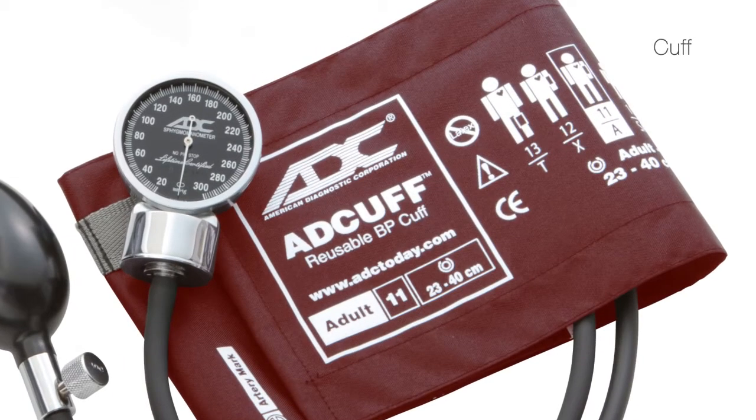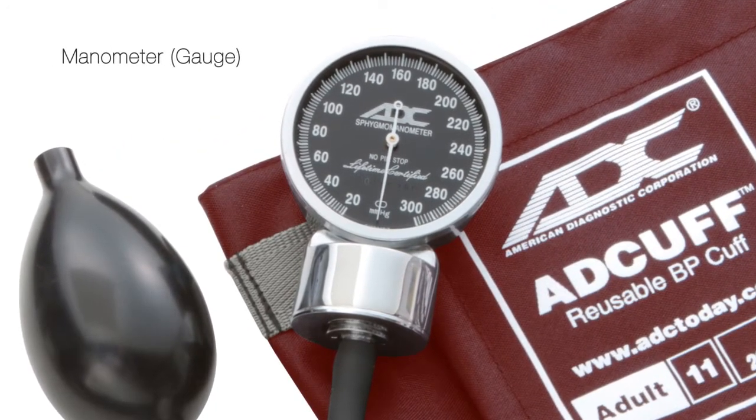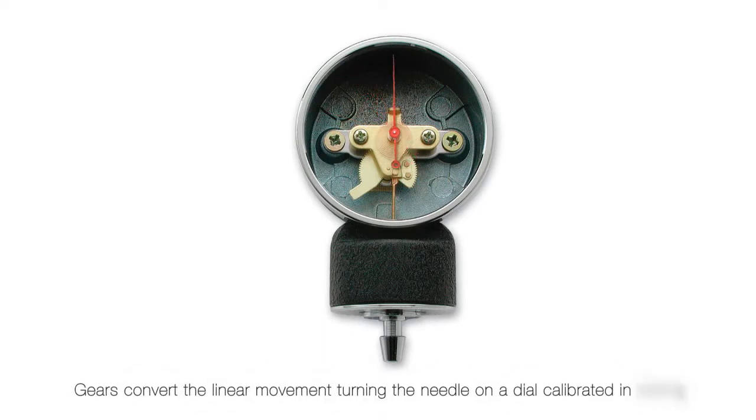Each sphyg component contributes to the instrument's overall accuracy, but none more so than the manometer. That is why we refer to the gauge as the brains of the system. Aneroid manometers use a watch-like movement to measure the air pressure applied to the cuff.